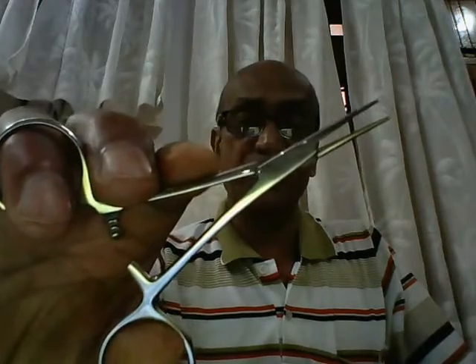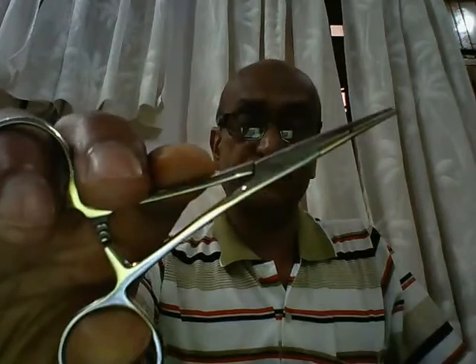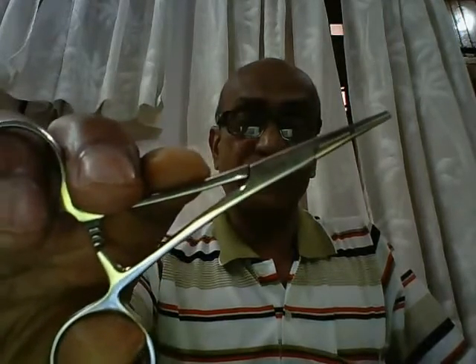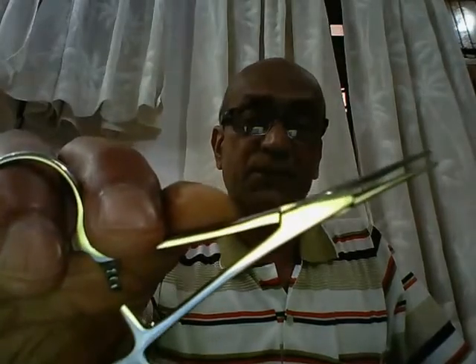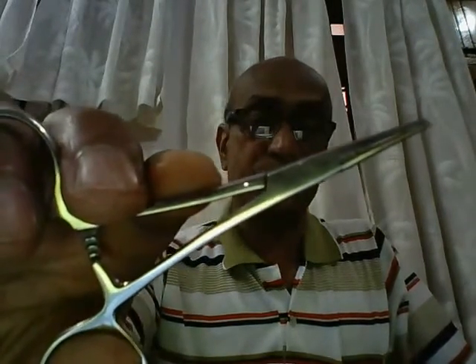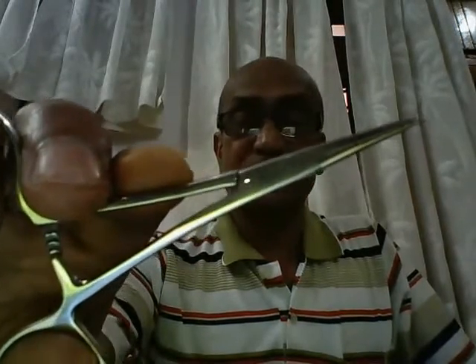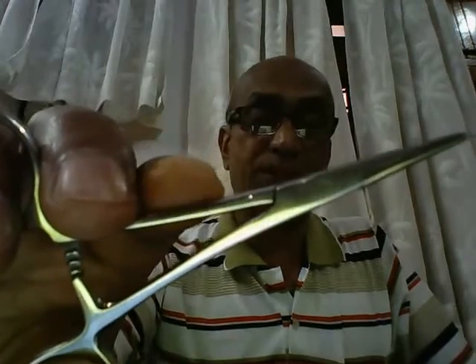The first instrument that you see here in front of you is known as a pair of artery forceps. There are plenty of types of artery forceps, depending on their sizes and whether the tip is straight or curved. This is a straight artery forceps, and because it is four inches or less in length, it is also referred to as a mosquito or Halstead forceps.